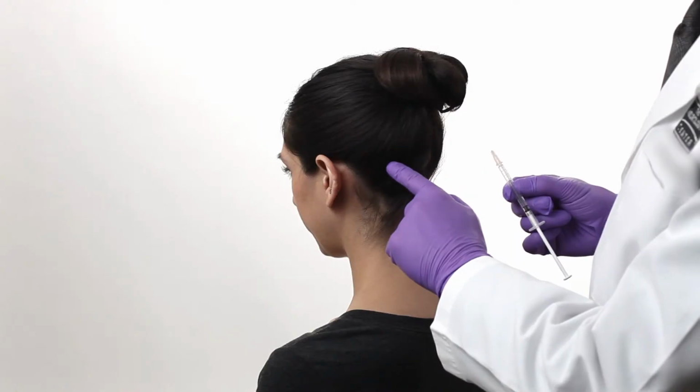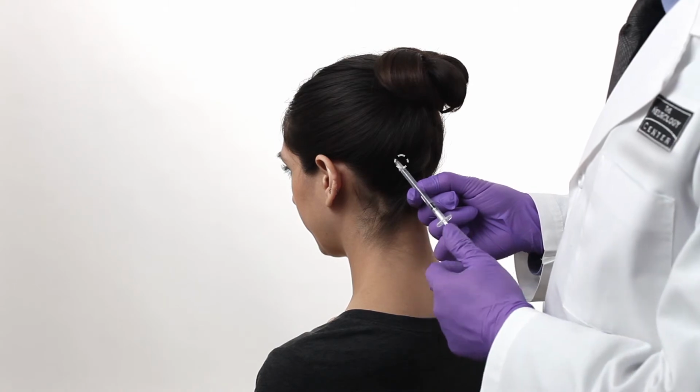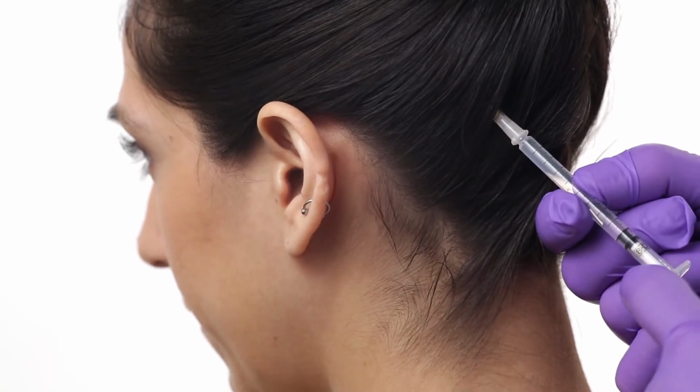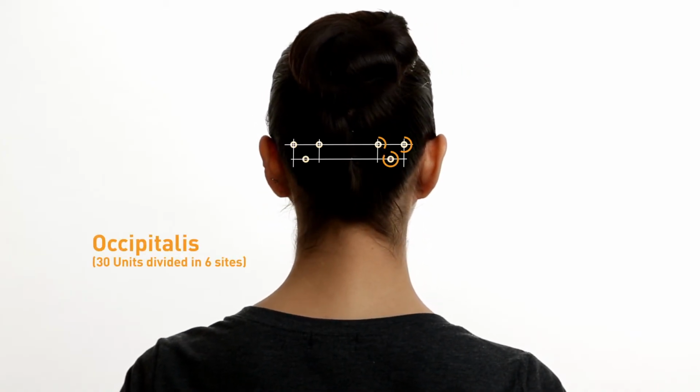To locate the third injection site, measure diagonally 1 to 2 fingers breadth up and medial from the first injection at the 2 o'clock position. Make the injection. Repeat the 3 injections symmetrically on the contralateral side.